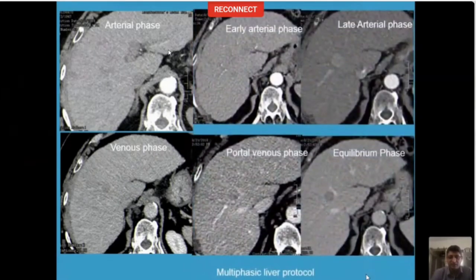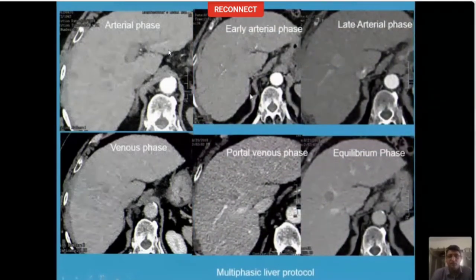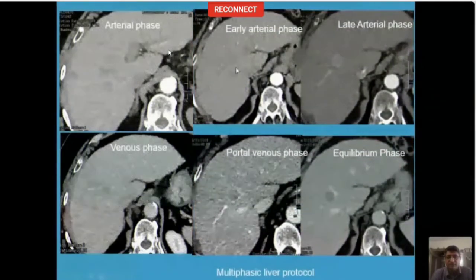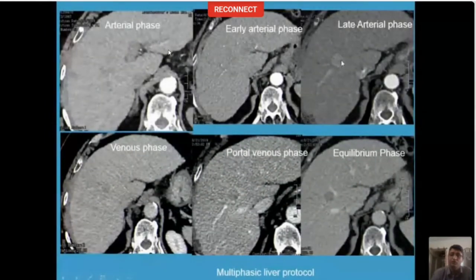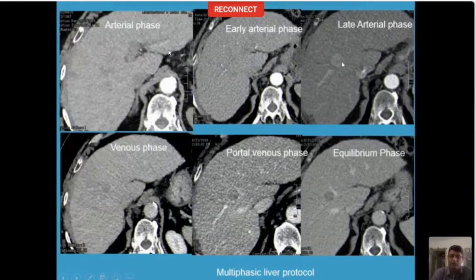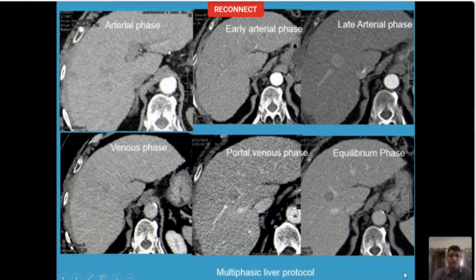We repeated the CT scan. Now that's what you see. That's the early arterial phase. Something barely is perceptible, but if you look at the late arterial phase, there's a very well arterially enhancing region seen which is showing washout in the later phases. So this is the quality of imaging that we expect from everyone.